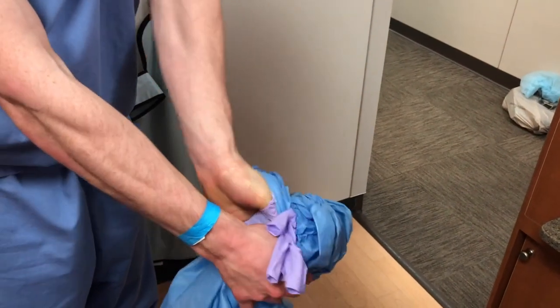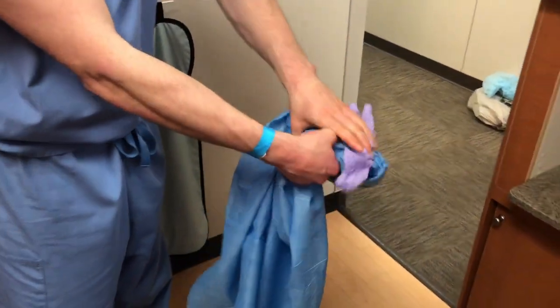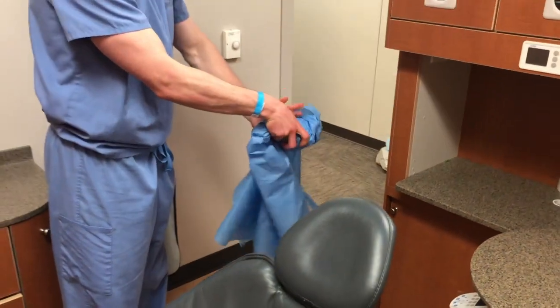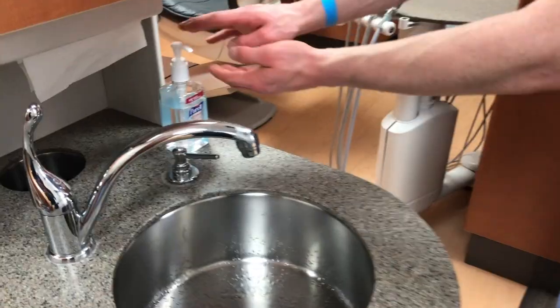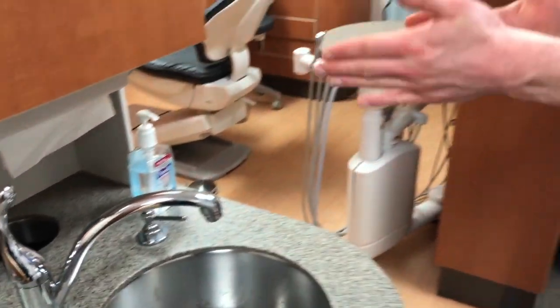If you do this correctly, the gloves should turn inside out. Roll the gown touching only the inner aspect, then discard the gown and perform hand hygiene.